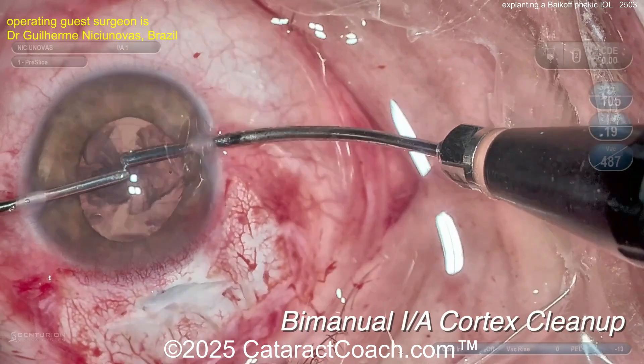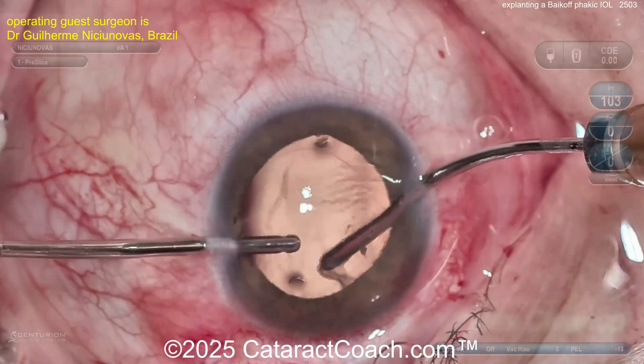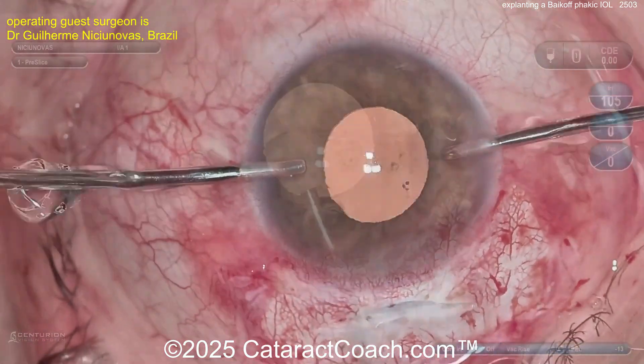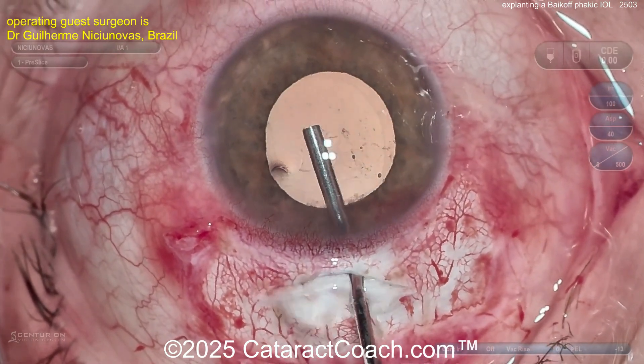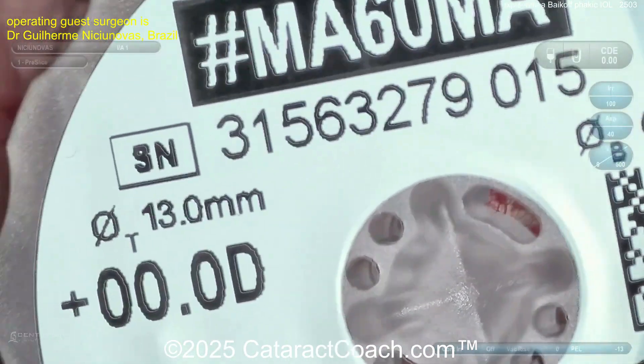Now you can use the bimanual IA to clean up the lens cortex — beautifully done. At this point you're going to put in a monofocal lens. For this high myopia patient, it'll actually be a very low power lens. Putting viscoelastic inside the eye to fill that capsular bag — looks great. The lens is an Alcon 3P, zero diopter.